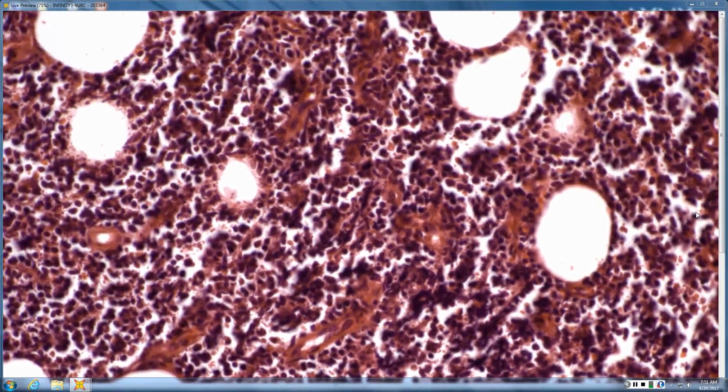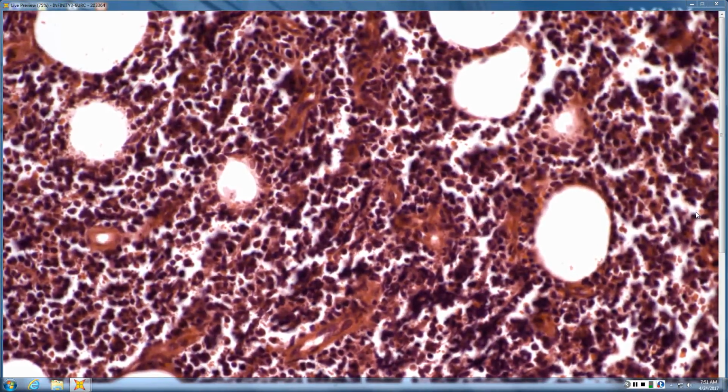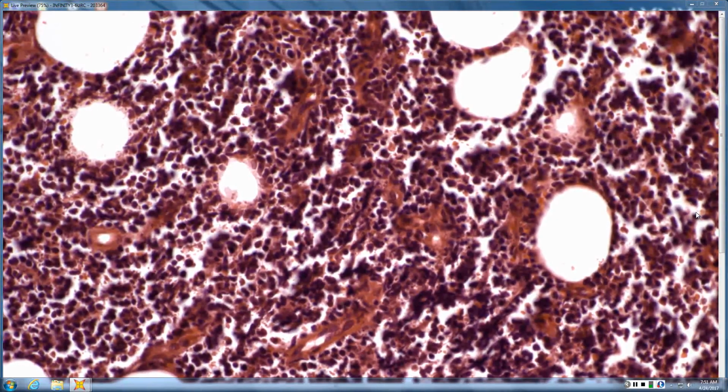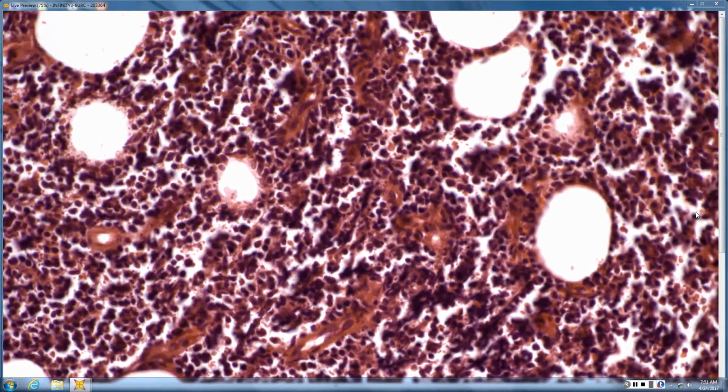So anytime anyone's talking about a centrocyte versus a centroblast, a capital B has two circles, which helps remember it's round. A C is cleaved, right? So cytes are cleaved, blasts are round. Immunoblast has the nucleolus smack dead in the center like a bullseye. Centroblast has the nucleolus on the side.